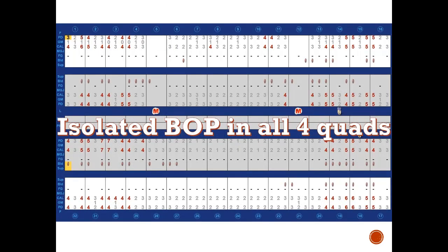So here she is. If you look at the upper right, which is up here, multiple bleeding sites, not really bad pockets, some fours and fives. We go to the upper left, more bleeding pockets, more fives. We go to the lower left, more bleeding pockets, and look at the lower right. If you add it up, there's like 40 bleeding pockets. That's a lot of bleeding pockets.